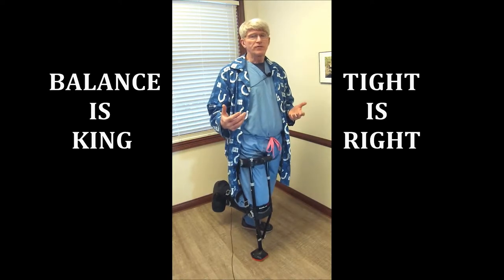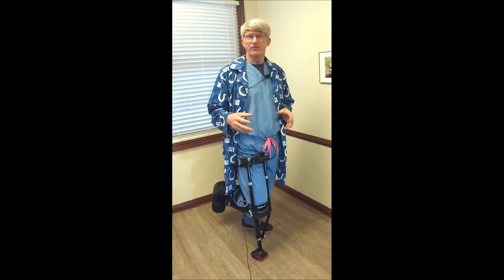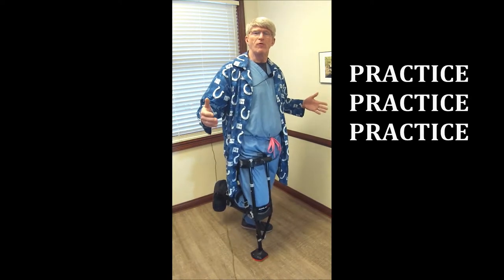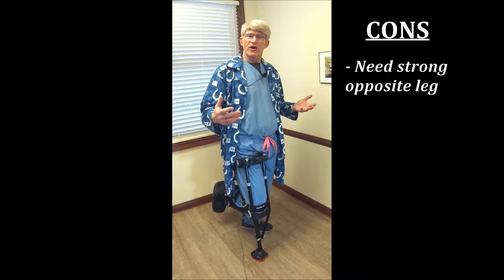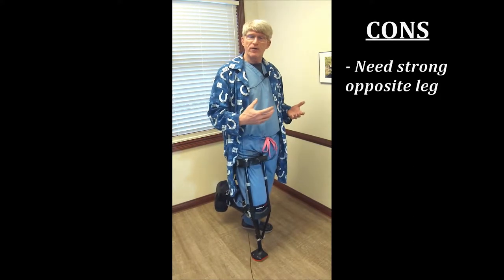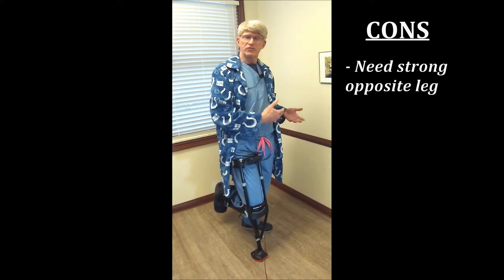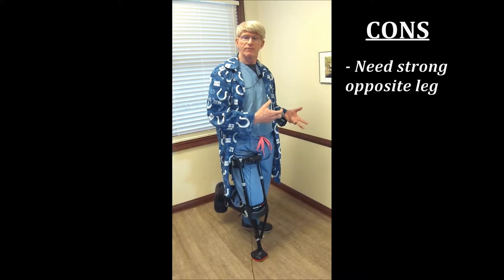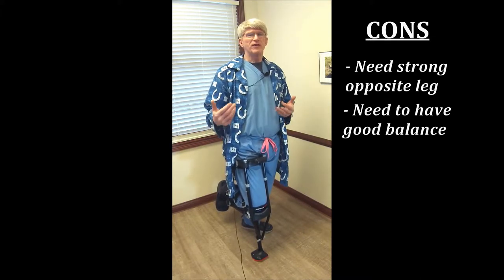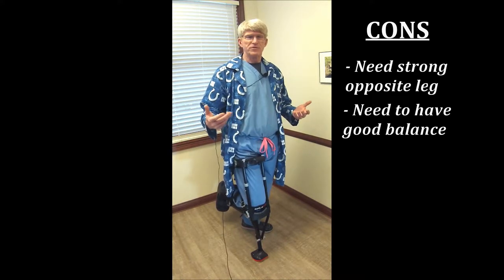Balance is king. If you don't have good coordination or balance, this is not your option. Practice in a safe environment — I recommend starting off in a pretty narrow hallway. You also need a very good leg on the other side. If you have a hip, knee, or foot problem there, it's probably not a good idea because you're so dependent on that leg — it's doing twice as much work. It took me about two or three days to get very accustomed and used to this, so judge it accordingly.